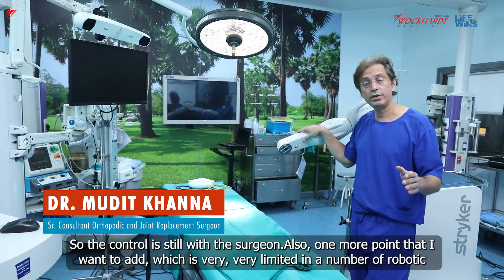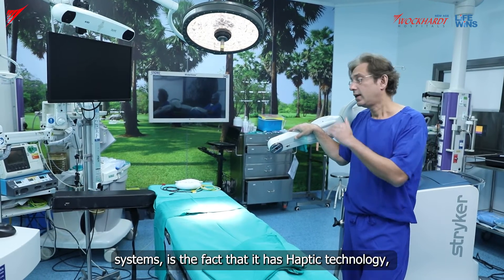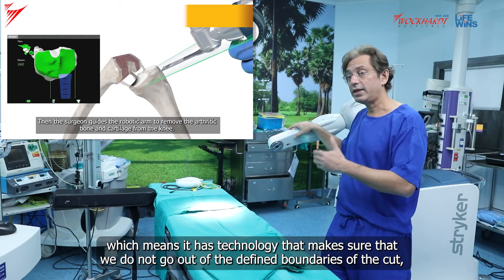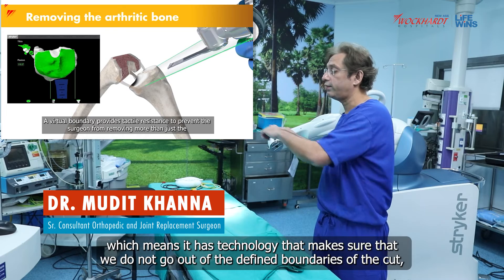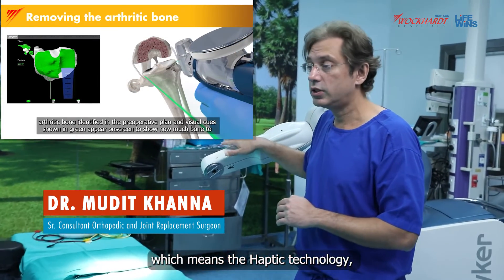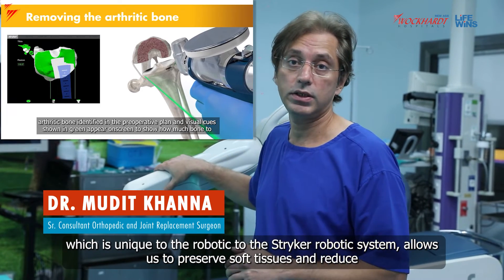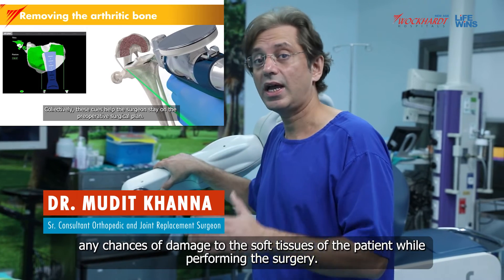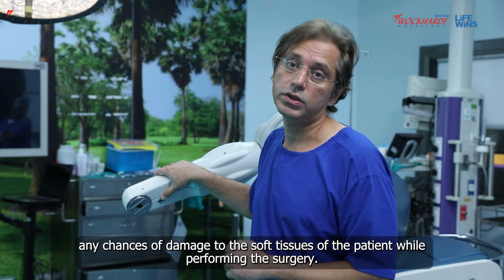One more point I want to add, which is very limited in a number of robotic systems, is the haptic technology. This technology makes sure that we do not go out of the defined boundaries of the cut. The haptic technology, unique to the Stryker robotic system, allows us to preserve soft tissues and reduce any chances of damage to the soft tissues of the patient while performing the surgery.